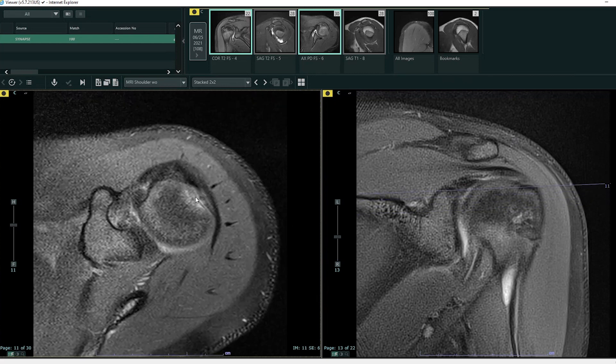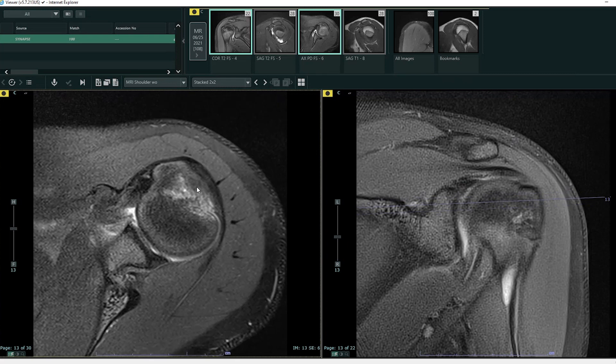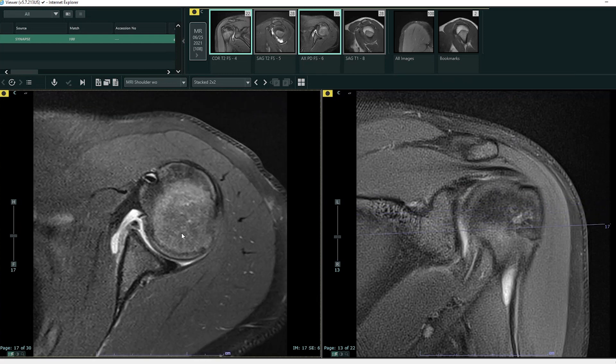Coming from superior to inferior, the humeral head should be a nice round circle as we head more inferiorly — it should have this nice round shape. Unfortunately, what we're seeing here is an impaction fracture. Hopefully you can appreciate this marrow edema and notice that the contour of the humeral head is different here than it is here. This is what happens when a patient dislocates anteriorly — the humeral head moves anteriorly and bangs against the glenoid and the glenoid labrum.